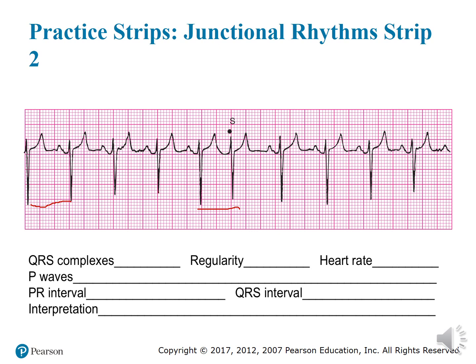Well, yes, there are P's right here. Sorry for my little circles. All right. So yes, we have P's. For every QRS, there is a P wave, and it's married to the QRS. So yes, we have P waves, and they are married to the QRS. So therefore, now we can figure out our PR interval.